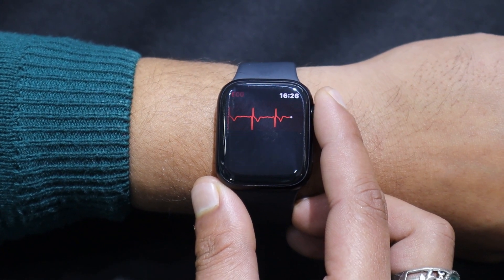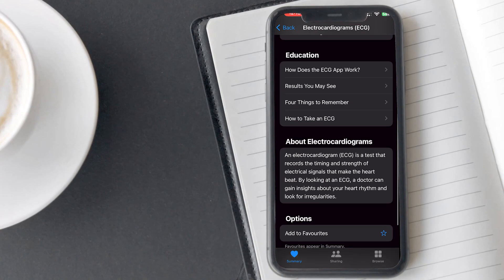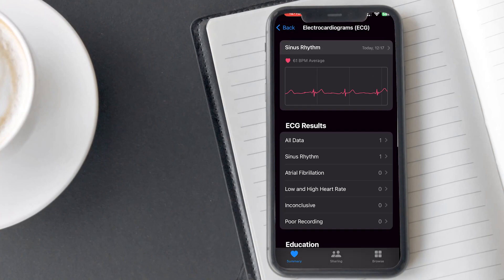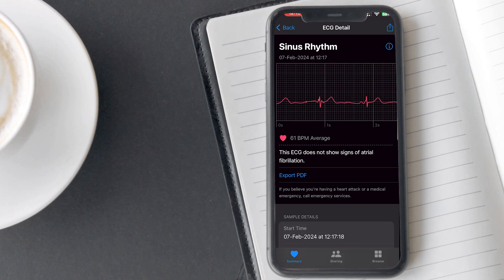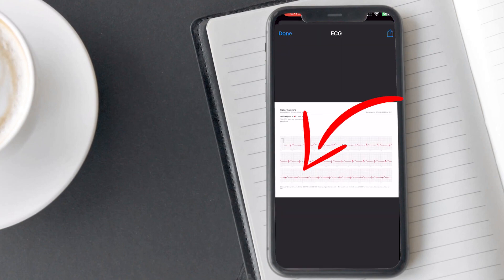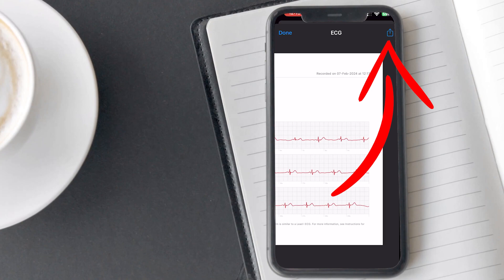Let's see the ECG results on the Health app. I got a sinus rhythm, which means my heartbeat has a uniform pattern. You can see the graph by clicking here. Slide left to see the complete chart. From here, you can download it in PDF and you can also share it with anyone.